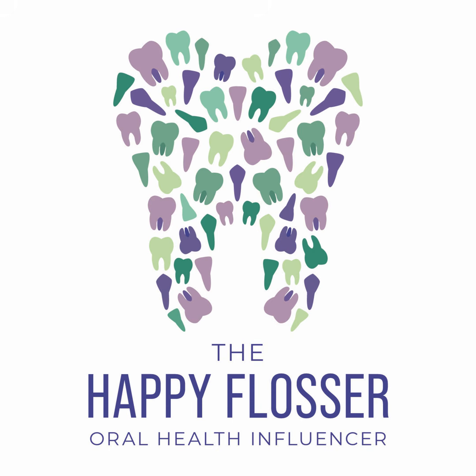Now, a full mouth series is a very detailed diagnostic set of radiographs, which can be a series of about 20 films, depending on how the anterior radiographs are configured. You will have 2 images in each quadrant of the posterior sextants, so that's 8 images, and then you will have 6 images of the anterior teeth, so that's 14 images, and then usually that comes with 4 bite wings, sometimes 6, depending on the office.